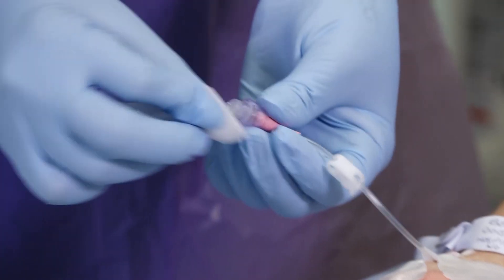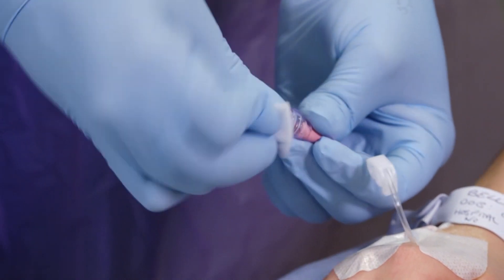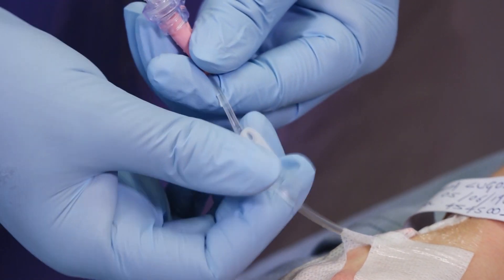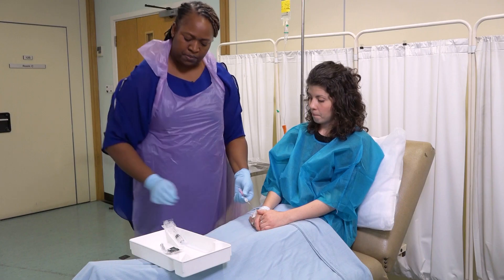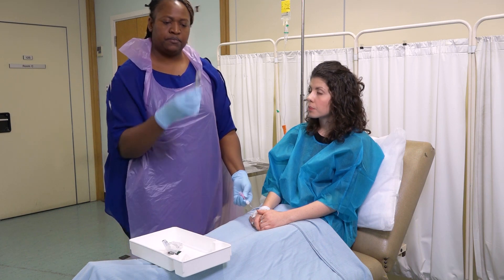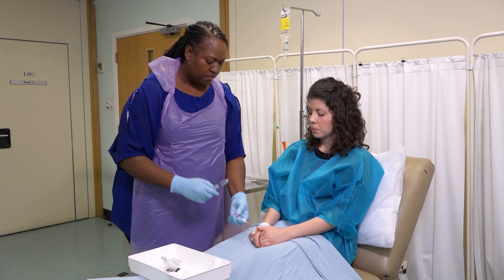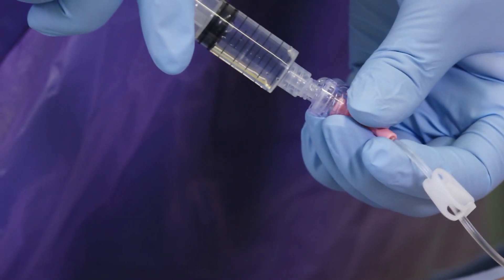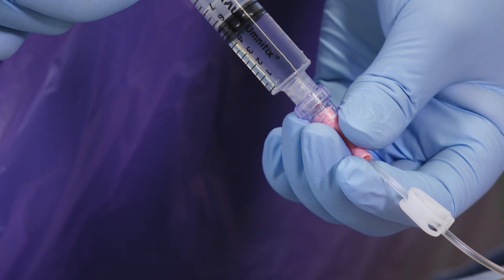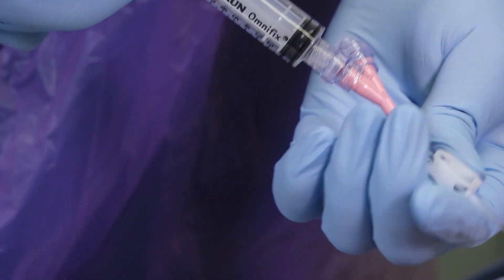Clean the cap on the cannula with an alcohol wipe. Open the clamp and ensure there are no air bubbles in the syringe. Flush the cannula with the saline flush to ensure it is clean and patent. Now close the clamp.